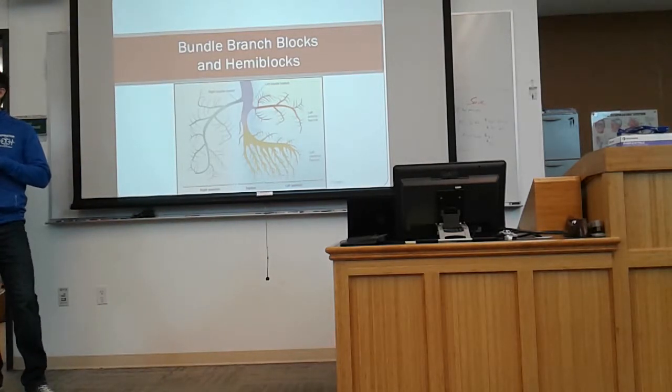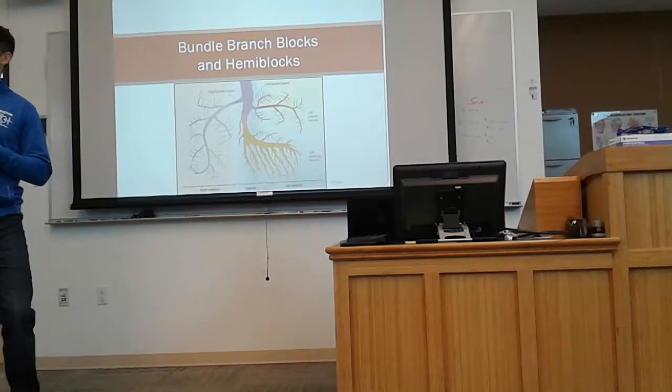Like, if you're looking and you have R and then you have R prime, one of those is going off in the normal fashion, and then the second one is delayed, and so it's been delayed long enough where it's the contractile cell going. Why is that R prime not significantly different than R?